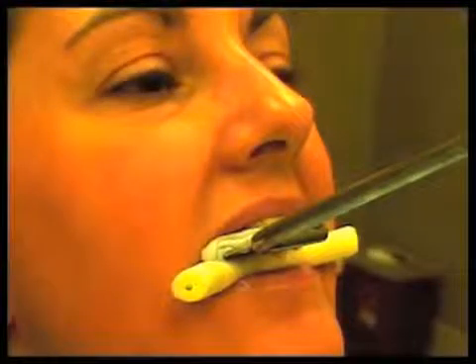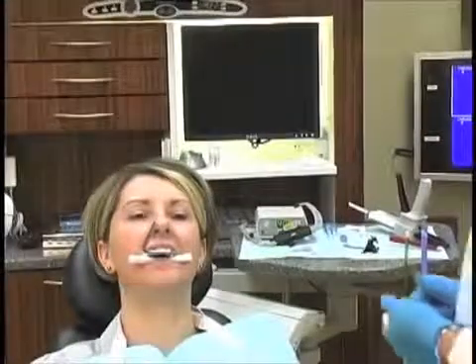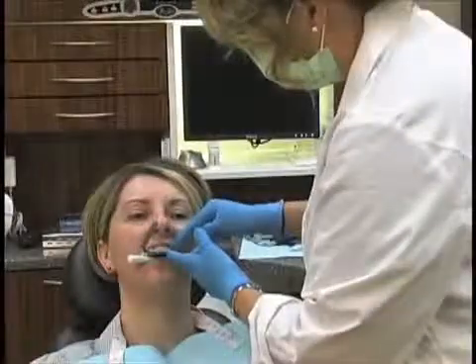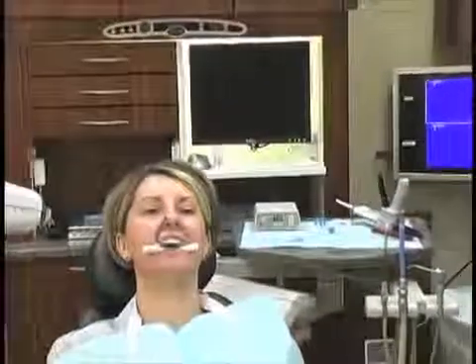And here again, I've seen doctors trying to have the patient hold it there. And this is just a really simple way to get that part of this process done. So the next thing we're going to do, make sure that that's setting up okay, is get the ear bow. And we can go ahead and get the ear bow in place.